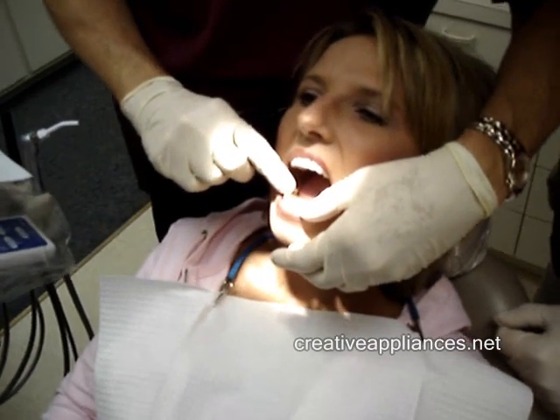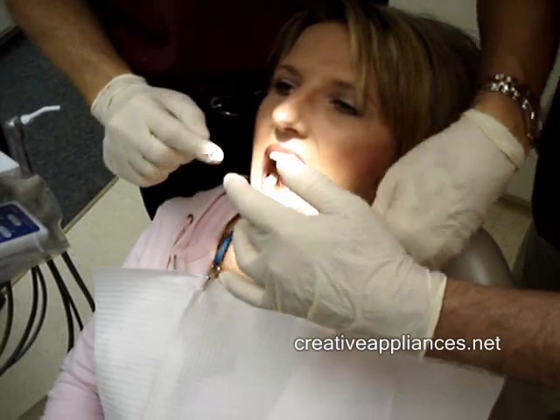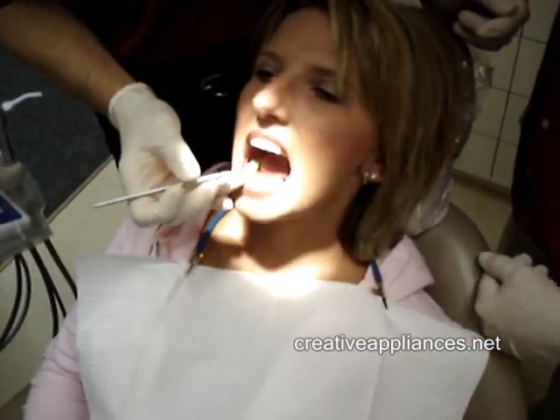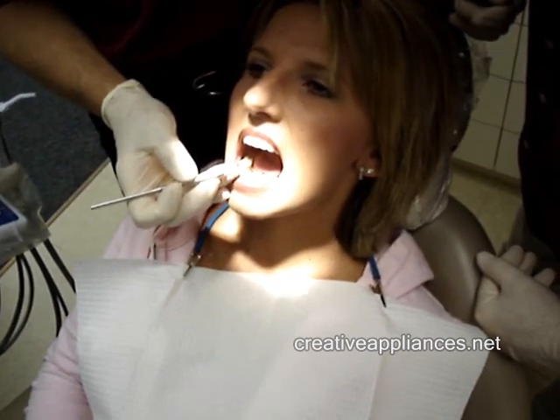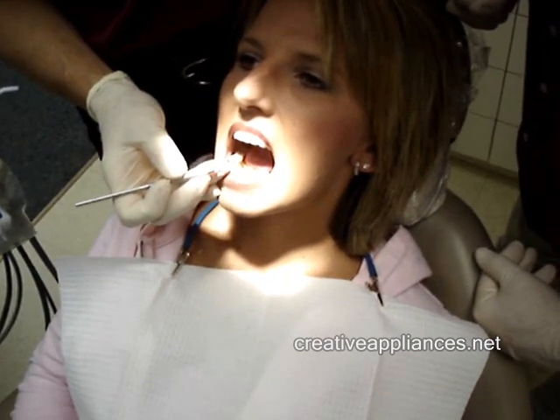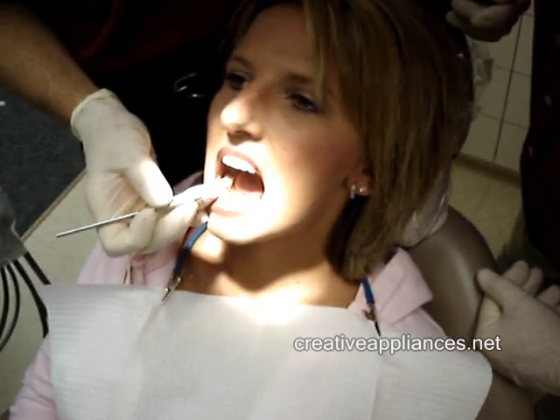Put a little cold cure on that. And like I said, I'll make an adjustment on that bow because we've got to get it off that tooth. One thing I'm going to ask — I don't know if you can see with my magnifiers — there's a little lip on the acrylic right over here and it'll probably engage that line angle. Do we want that or do you want to get rid of that?